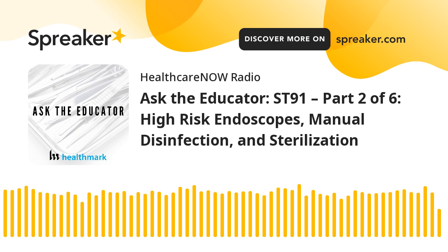That's a great point, Kevin. And I remember when we made this decision as a working group, just again to give you some background, I stopped and thought, wow, we really just did this. Do we even know what the impact of this is going to have? But let's start with what the new document says. So with this new release of ST91, we really made the distinction that we no longer recommend manual disinfection. So what does that mean?